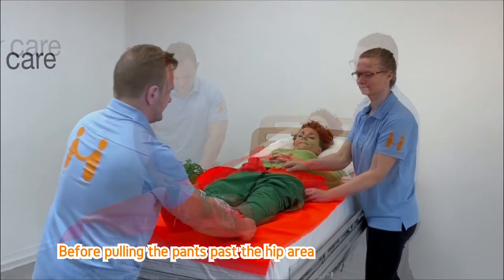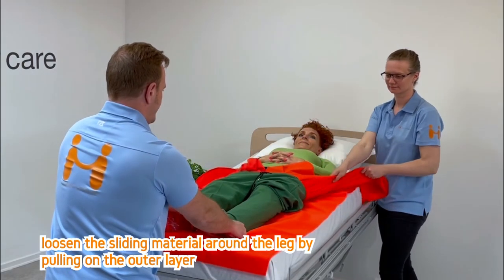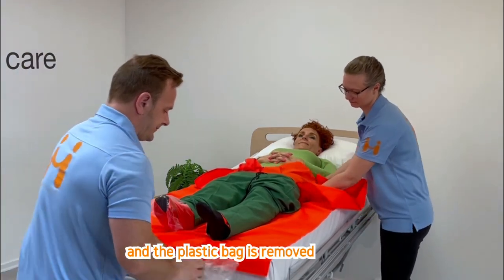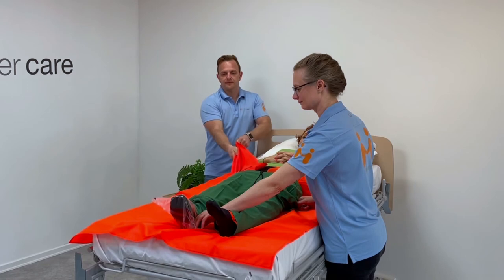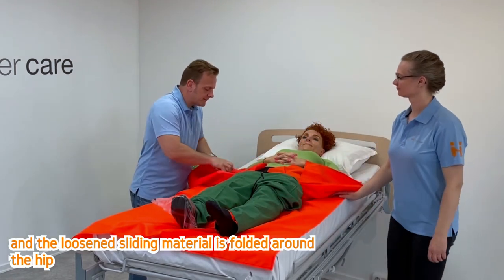Before pulling the pants past the hip area, loosen the sliding material around the leg by pulling on the outer layer. Remove the plastic bag. Loosen the sliding material on the opposite side, and fold the loosened sliding material around the hip.